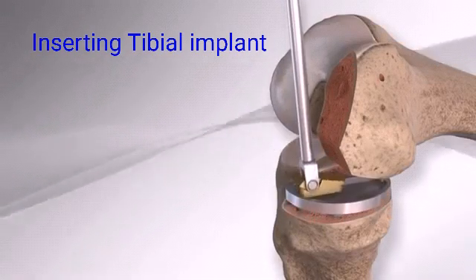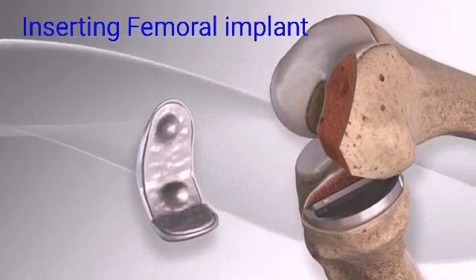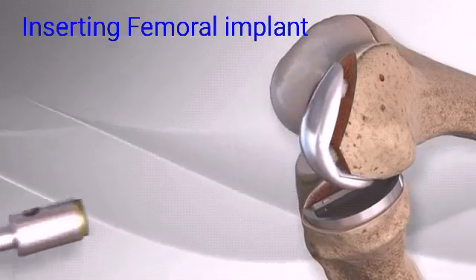The tibial implant is cemented into place, followed by the femoral implant and the plastic bearing surface.